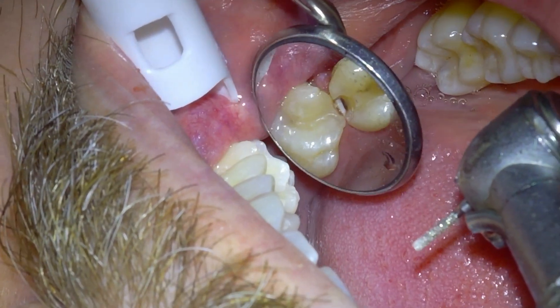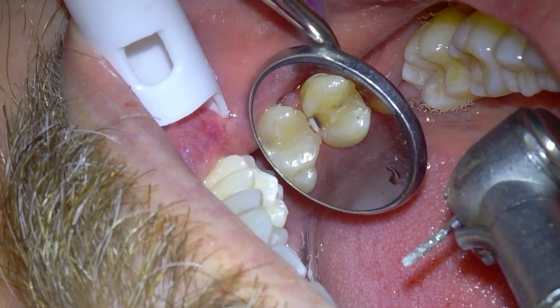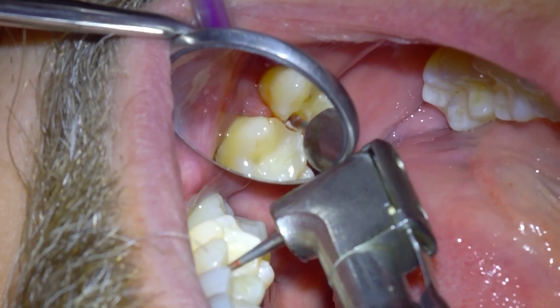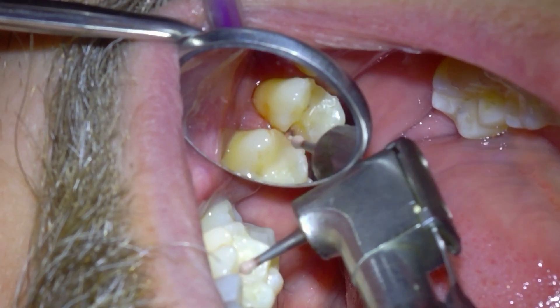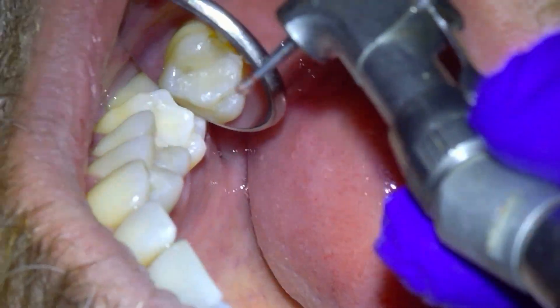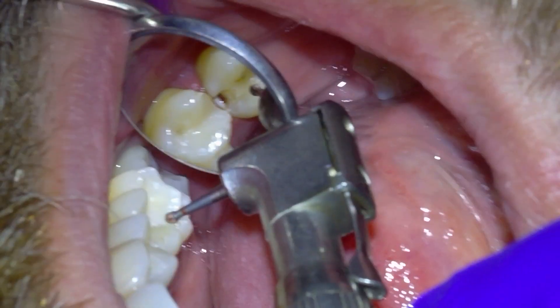Now that we've uncovered the decay on number 13, we'll switch from the high speed drill to a slow speed drill. We do this because the high speed handpiece is better and faster for drilling on solid teeth, while the slow speed handpiece is better for mainly removing tooth decay.